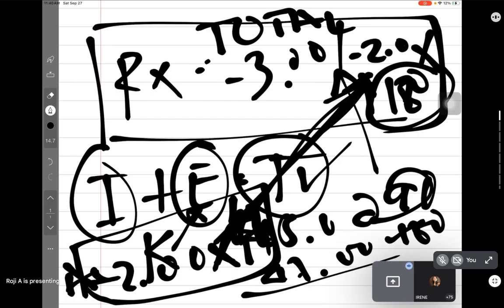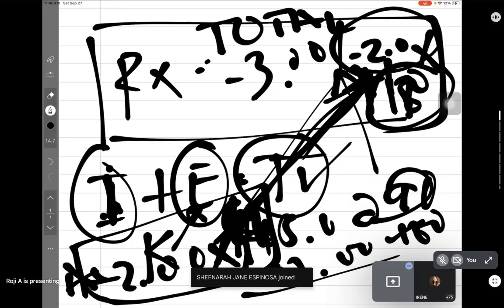So that's how you correlate. Now you'd know that my internal must be something different from the external, because I have axis 90. Maybe I have a 4 inside that is more of 180 rather, to create a minus 2 axis 180, because they're not the same, correct?